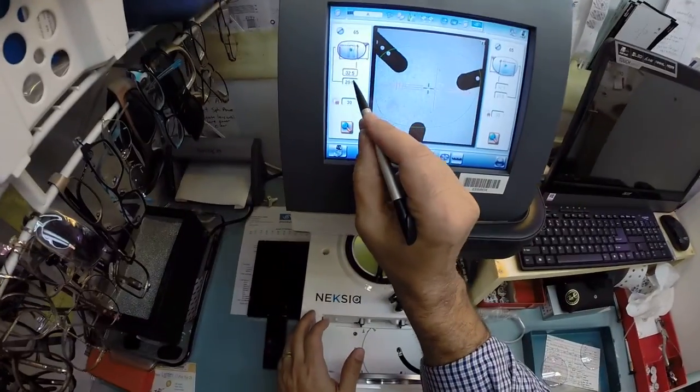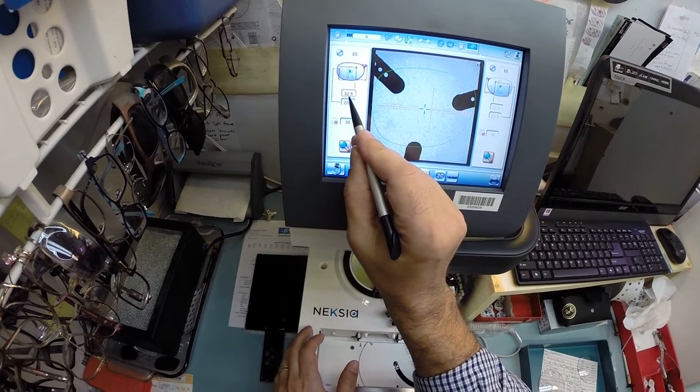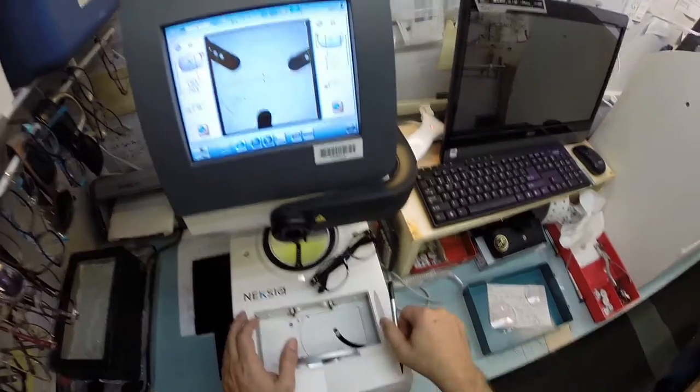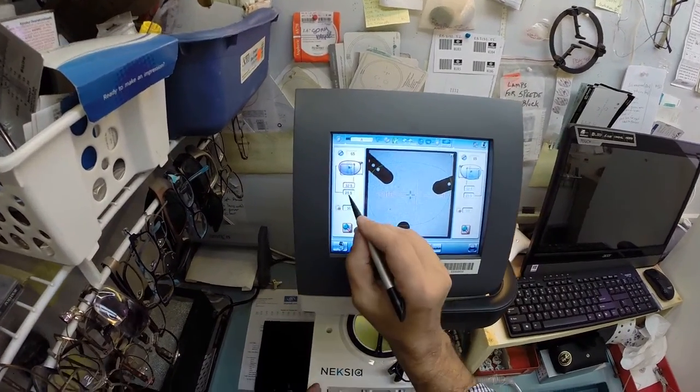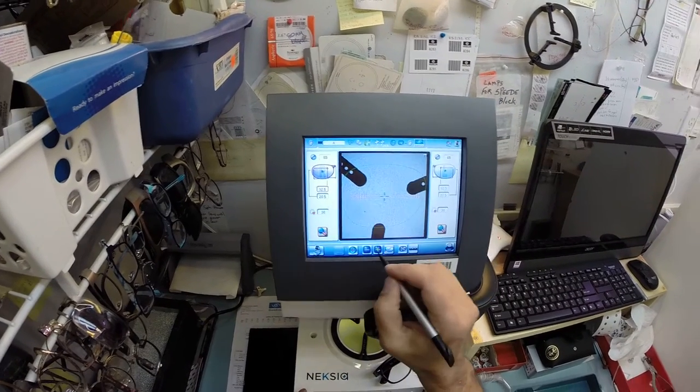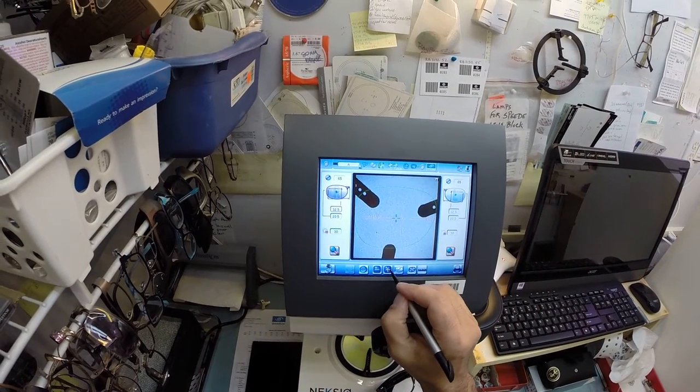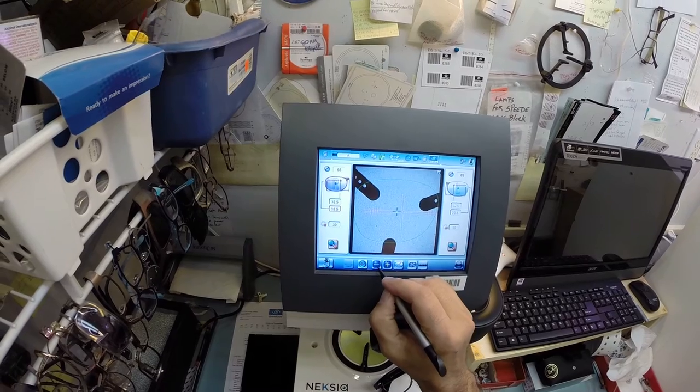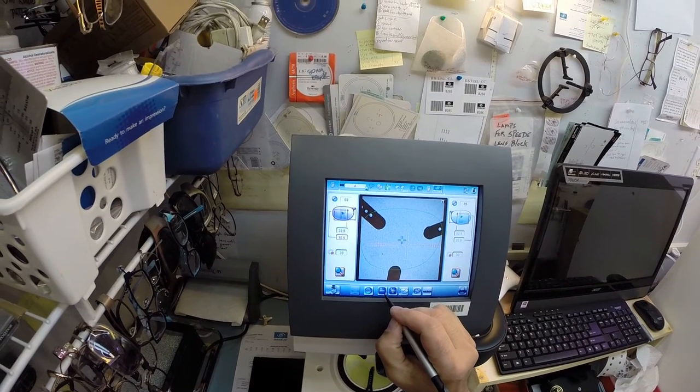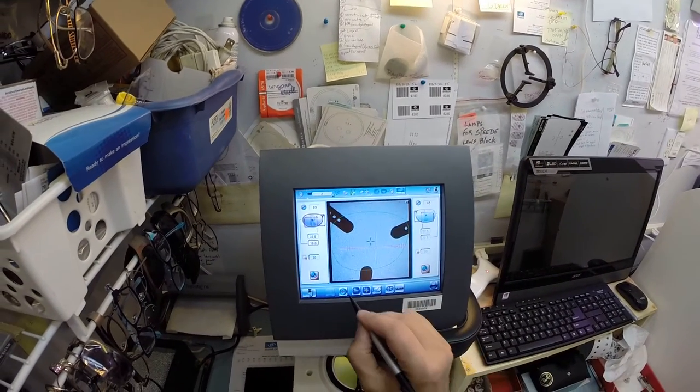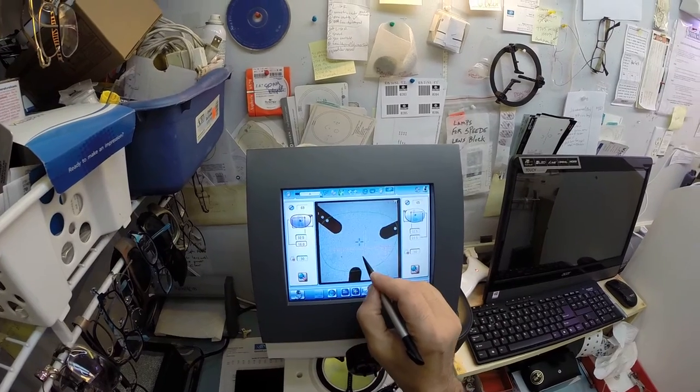It actually pops up the near distance. Your PD is 32.5 in both eyes and I'm actually going to go four below. Let me set your bifocal height there. We're going to go 16 and this is a bifocal so I'm going to put that in the graph there.